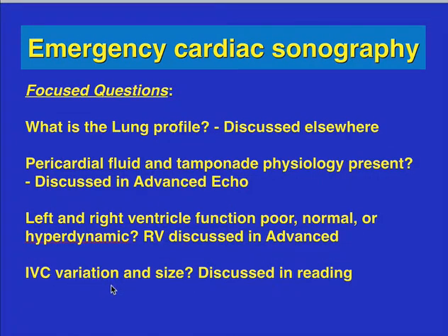So at the end of this, remember, emergency cardiac sonography has focused questions. What is the lung profile? Remember, we've discussed this elsewhere, and we have a whole module on pulmonary edema. Is pericardial fluid and tamponade physiology present? Remember, this is also discussed in other lectures. Is the left and right ventricular function poor, normal, or hyperdynamic?